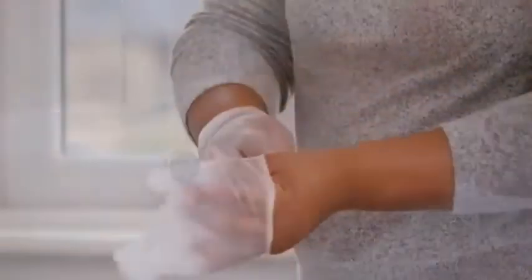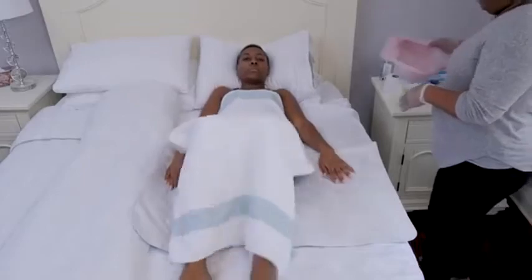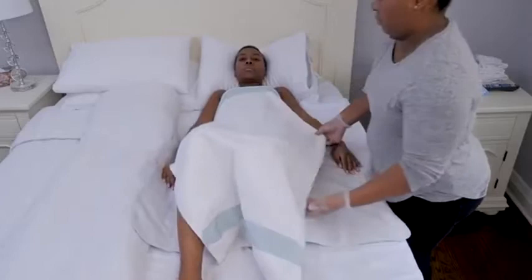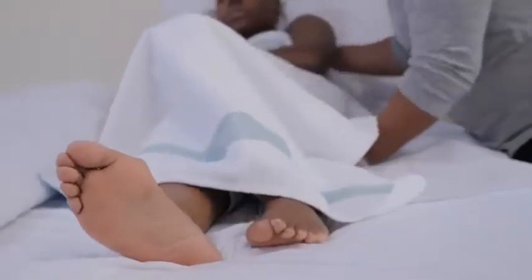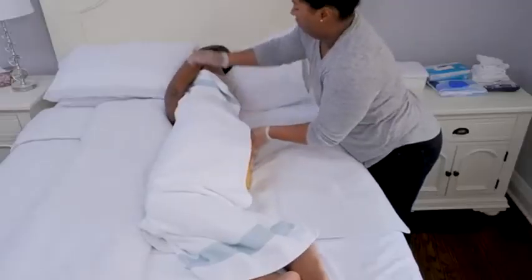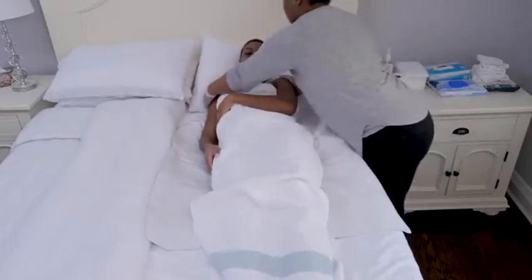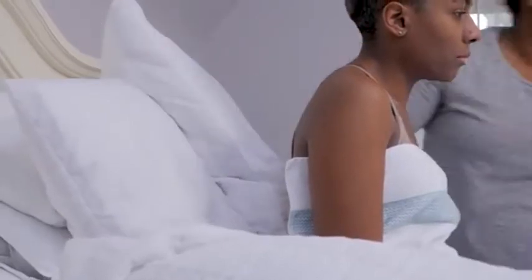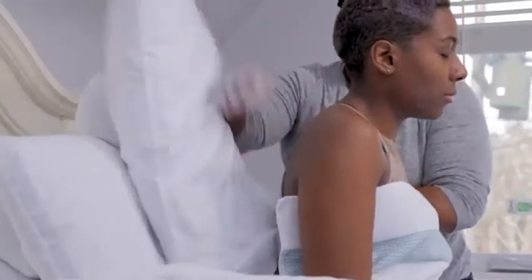Start by washing your hands and putting on gloves. If the person you're caring for can bend their knees and raise their hips, have them do that and place the waterproof pad on the bed and the bed pan under their bottom. If not, help them roll onto their side and position the bed pad and bed pan under them. With one hand holding the bed pan, help them roll back onto it. Getting the bed pan into position might take a few tries. Once it's in position, prop them up with pillows or raise the head of the bed until they're comfortable and upright.